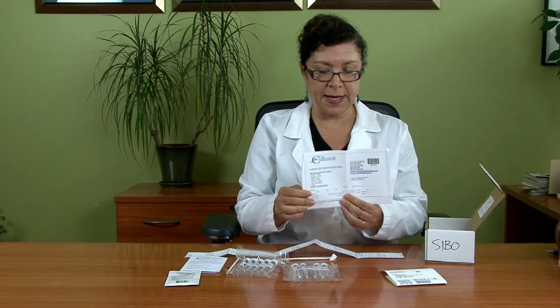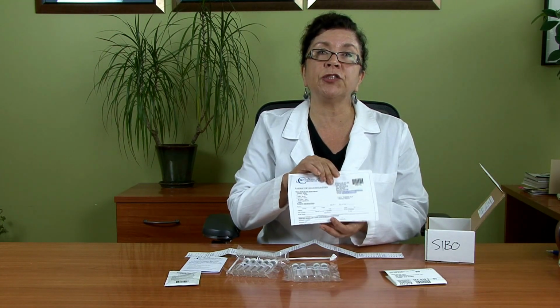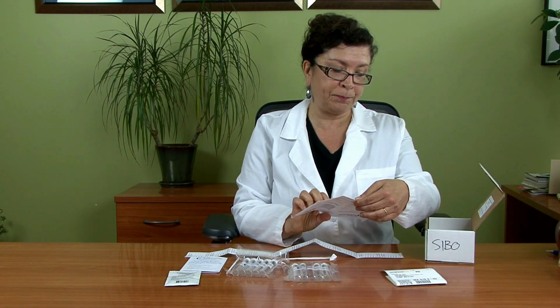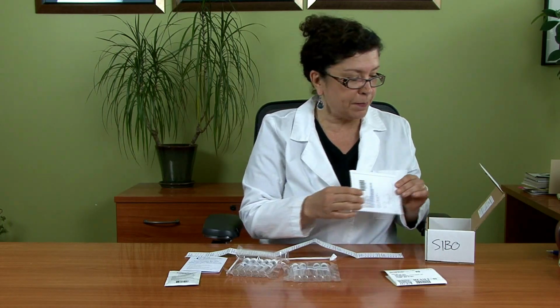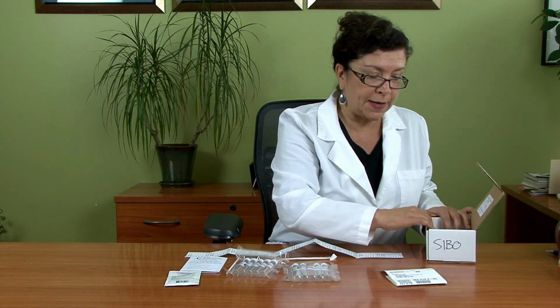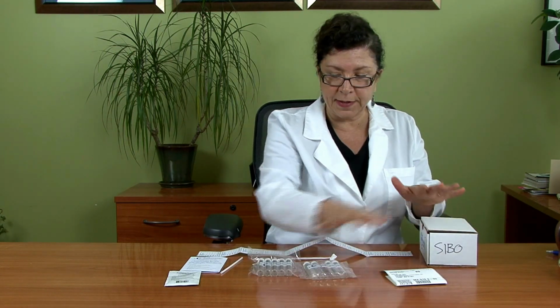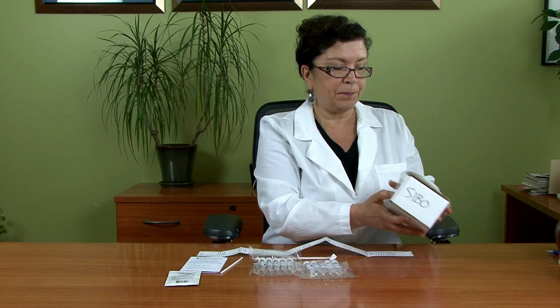Also, on this test kit, if you're paying out of pocket, please include a check, and there should be an area for a credit card. If you decide to do credit card, make sure you include the payment. Put the lab requisition inside the box. Close the box back up. Remember, everything's in here. You're going to take your label and put the label on the box correctly. Make sure you cover it up so the box is actually sealed.